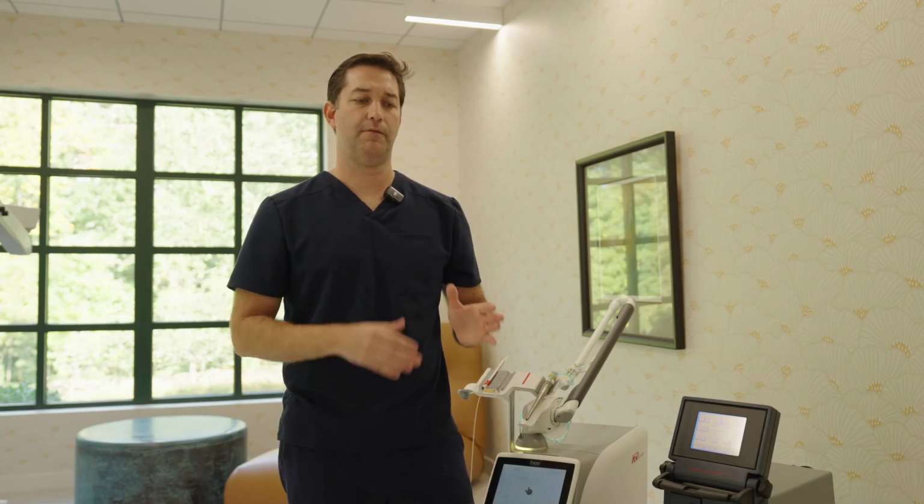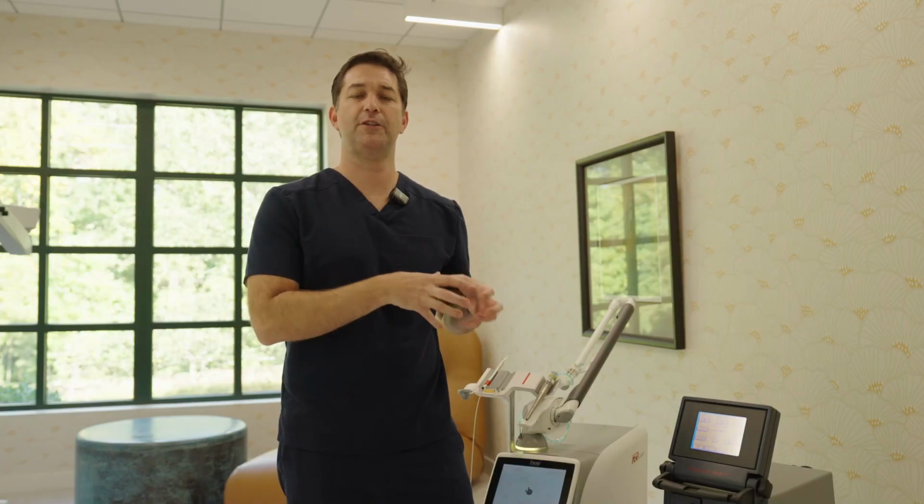And this is the machine that I use to provide the LANAP treatment. It's a laser unit. The most specific name for this laser is the Nd:YAG laser. It's a specific laser that can give us the results that are necessary to reduce the level of periodontal disease. It's a very specific type of laser that penetrates into the gum tissues and kills the bacteria and allows the tissues to heal and give us the resolution of the gum disease.